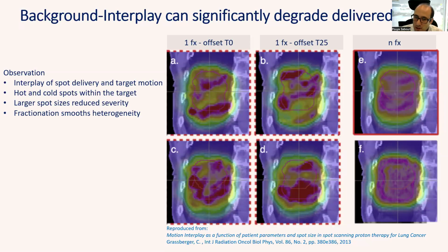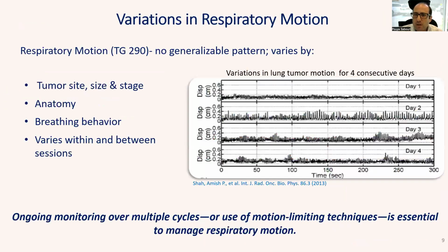And another important comment is to note that many physicians, from my experience, still expect individual fractions to closely approximate the planned dose, particularly in hypofractionated or stereotactic regimens. And so this also highlights the critical need for robust motion management strategies, such as gating or breath hold.